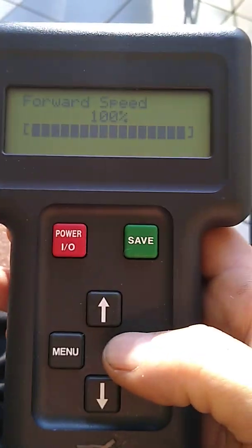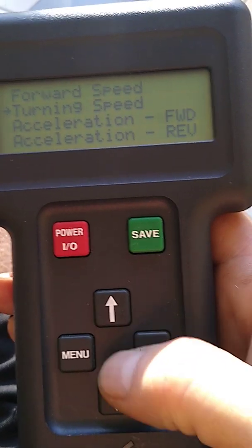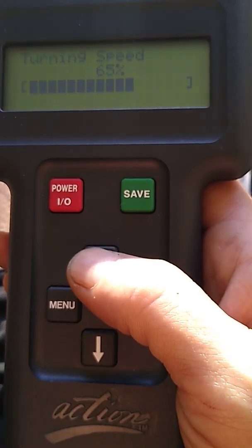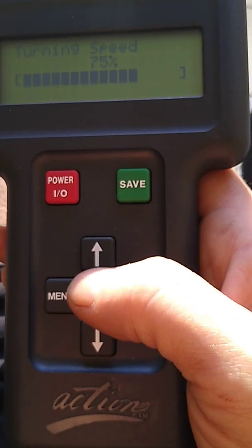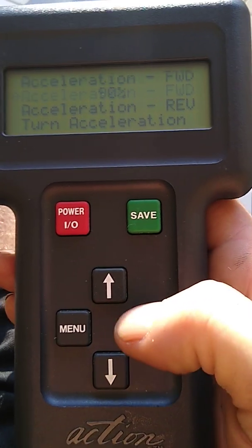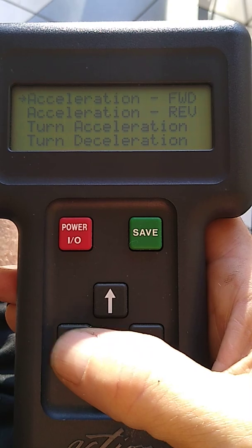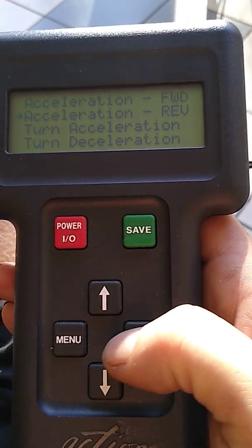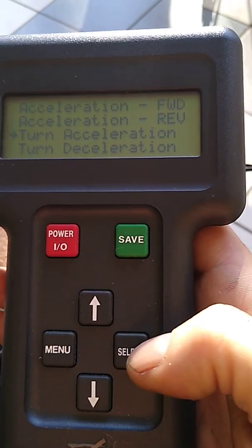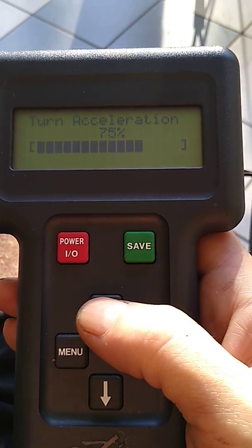Forward speed I now have set at 100%. Turning speed I have at 60%, but I'm going to bump that up to 75% because it's incredible. Acceleration forward was very low — I have it at 90%, which is the max, and it makes a real difference; you can do a wheelie immediately when you hit the throttle. Turn acceleration I'm setting to about 75% as well.